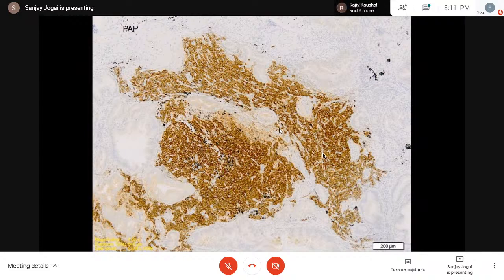It's just one of those antibodies which hasn't found as much favor. And when we are clinically happy that it's a lung primary, we always put that rider that 25 to 30% of lung adenocarcinomas can be TTF1 negative. And almost always clinically it has been fine and they've gone ahead and treated.